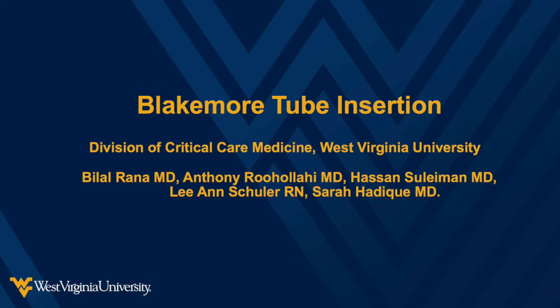In this video, we will discuss the indications and contraindications for placement of a Blakemore tube, demonstrate the proper insertion of the tube, and provide some recommendations for maintenance and removal of the tube.